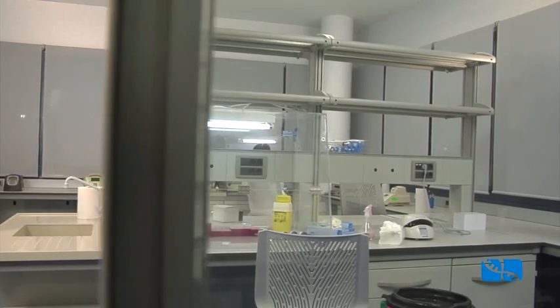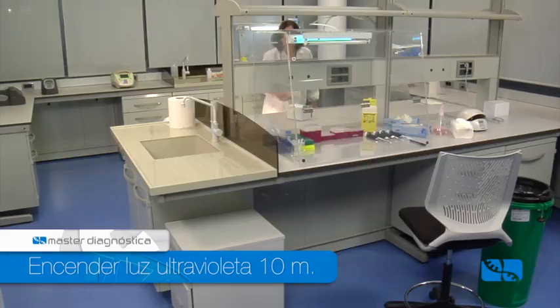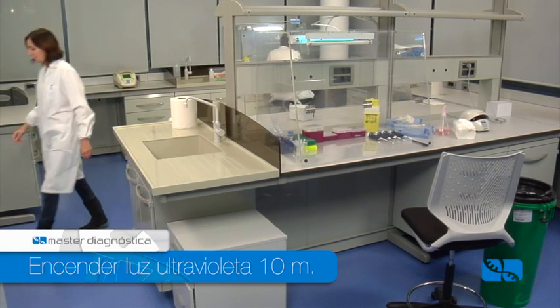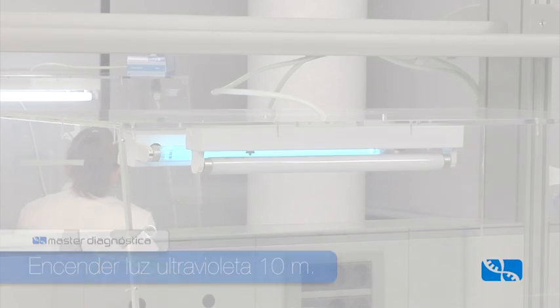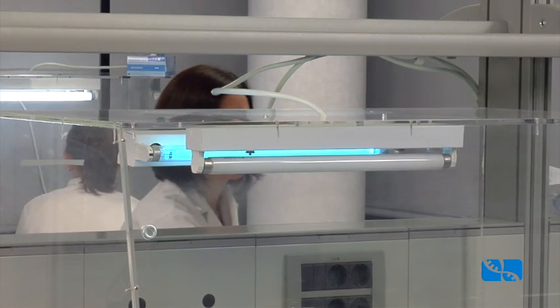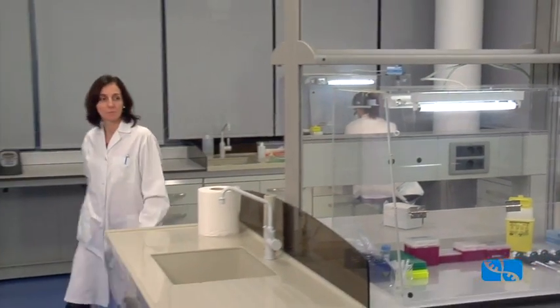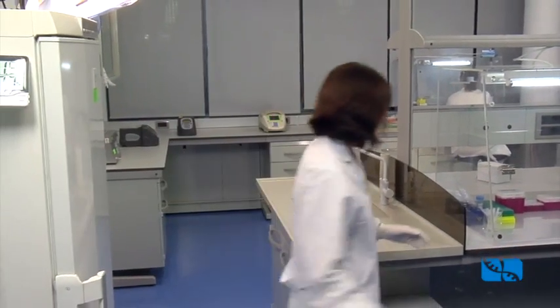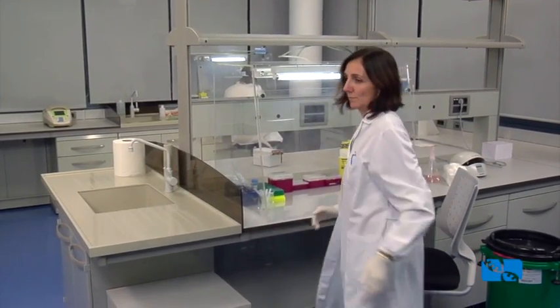After finishing with the cleaning step, it is highly recommended to switch on the UV light for at least 10 minutes. Once this time is over, one can start processing samples. All kinds of samples must be manipulated under a hood in a different room from where PCR and post-PCR steps will be performed.